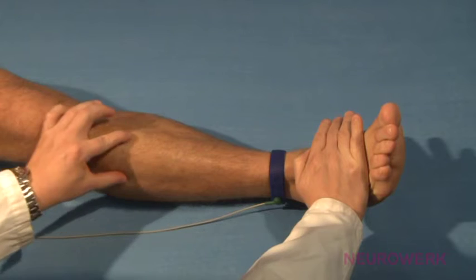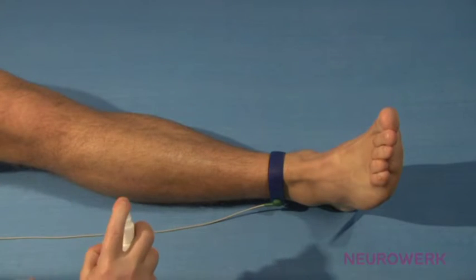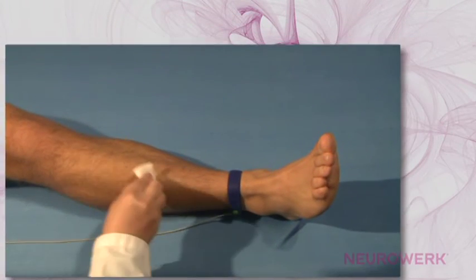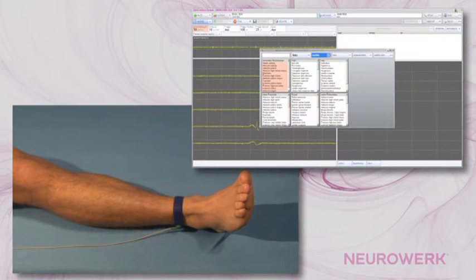At the beginning of the examination, the examined muscle is shown by activating the muscle. From there, the later injection site is disinfected. The moisture grounding strap is then attached to the patient and connected to the device. The examined muscle and the examined site need to be selected on the device, and the sound reproduction is then turned on.